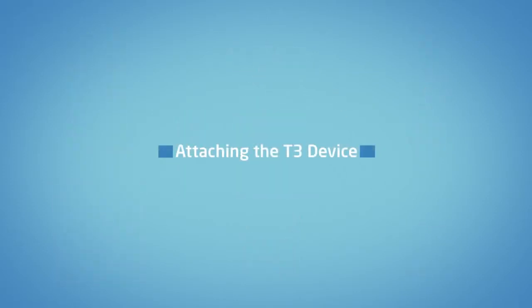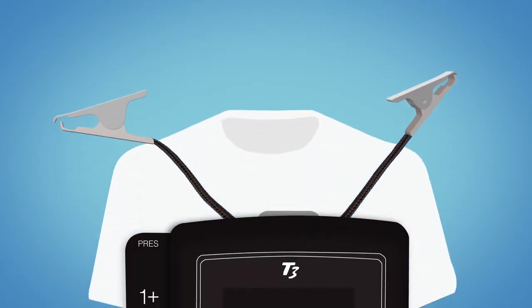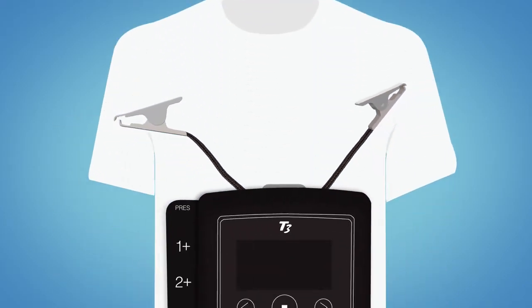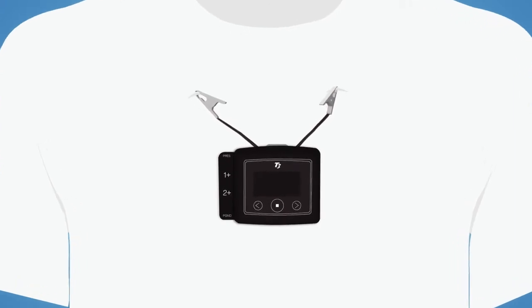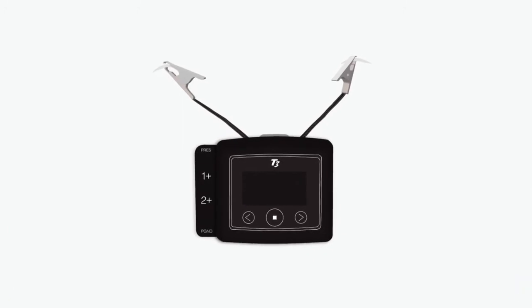Attaching the T3 device to your t-shirt. Snap the two alligator clips of the T3 device close to the collar of your t-shirt, so the T3 device is over your chest. Make sure the device display faces forward.